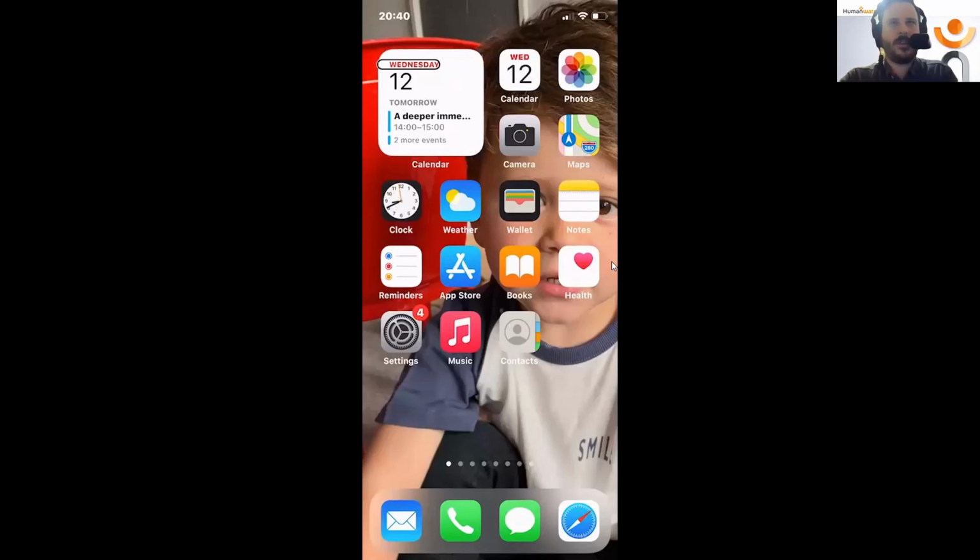And that one's very, very important because, again, as I said, if you want to play around and see, well, I wonder what C with space does, or I wonder what dots 1, 5, 6 with space does, which is how we answer a phone call, or I wonder what space with B does, which gets you out of it, or activates a back button. It will tell you exactly what those commands do without actually performing them. So it's a great way to learn, just like keyboard help is in JAWS. And it's something that I always like to make sure we mention.